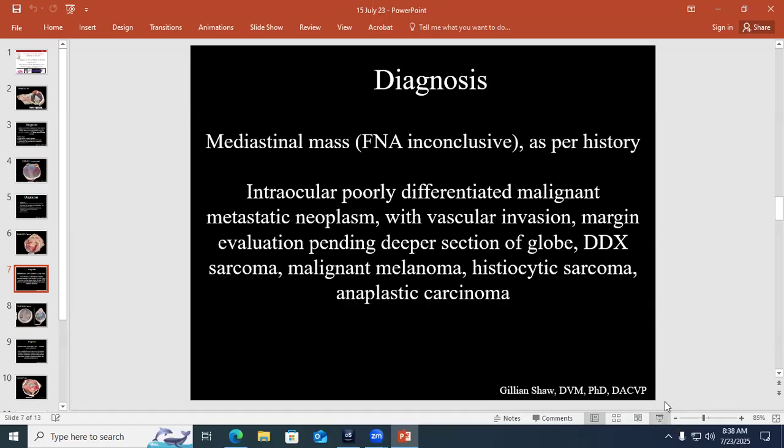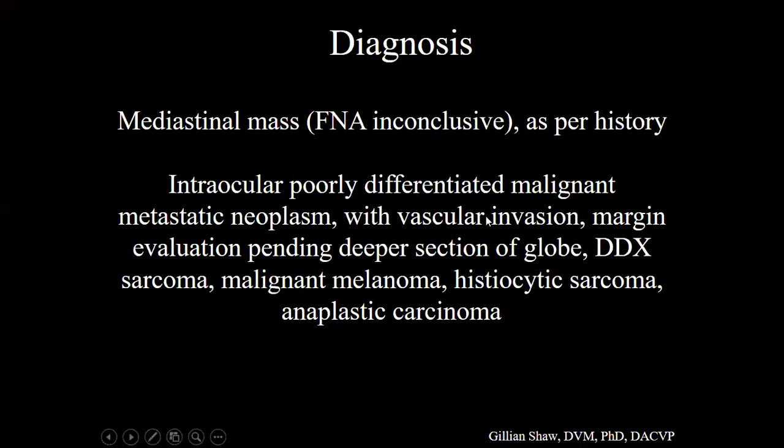And it's very hard. This spot is complicated, right? Because on our end, we could spend a lot of money doing immunohistochemistry and not get anywhere much more conclusive than where we are right now. Or the clinicians and the owner might want to use that money to do some systemic workup. Sometimes I do, and I know other people do also here in the lab, just by conversation, feel bad about not trying anything further and just saying, the ball's on your court right now, deal with it.